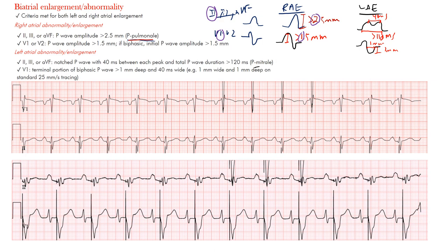Looking at our first example: in V1, the terminal portion is clearly at least one millimeter deep and one millimeter wide. In the second tracing, V1 is quite deep and wide enough. You can also see that the P waves are somewhat wide with some notching — not a perfect M-shape, but wide enough. In both cases, left atrial enlargement was present.